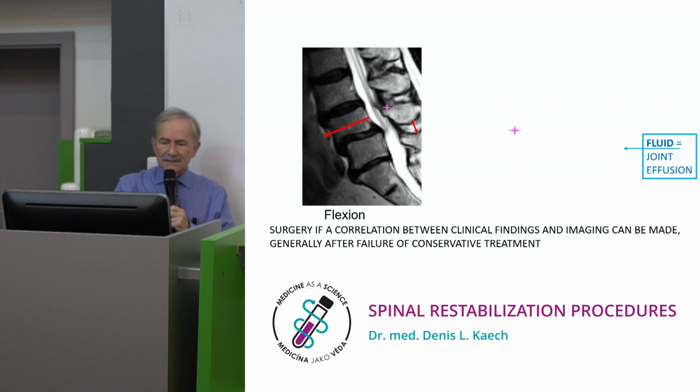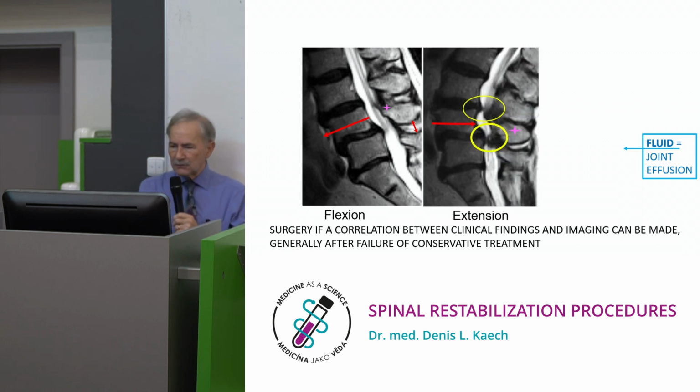Now, this dynamic MRI, you see some anterolisthesis of L4 on L5. You look at the spinal canal and you see white liquid CSF. It's very good. You need to see CSF here, maybe a little more. Maybe there could be a stenosis, but do we really know with only a recumbent image or a flexion image? You need to go on.